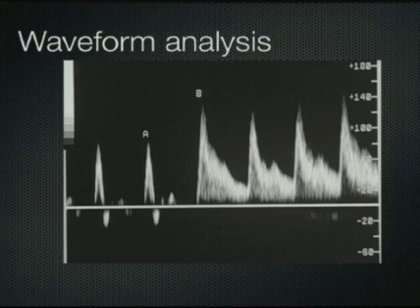throughout most of diastole. This change between high resistance and low resistance can be produced very easily by simply inflating a blood pressure cuff over the forearm and sampling in the brachial artery central or proximal to the pressure cuff.